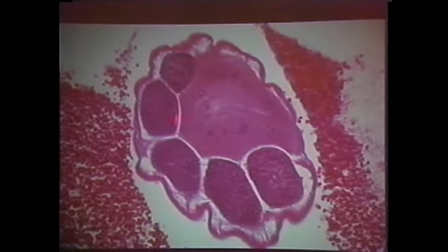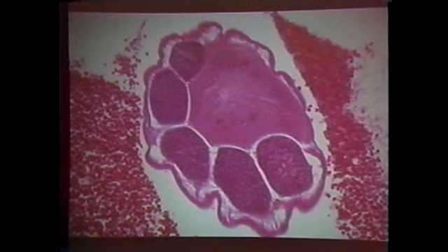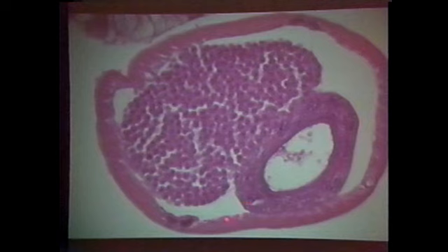But it's the muscle that's different. It's coelomyarian. Look at that. That's a large intestine. This is a large intestine. Okay? This is coelomyarian musculature. You see it's not smooth anymore? Right here, you see? And that, even though it has that, it is still a strongyle.